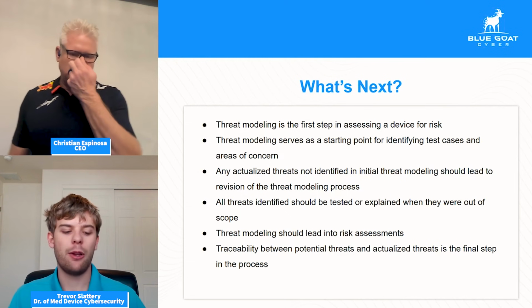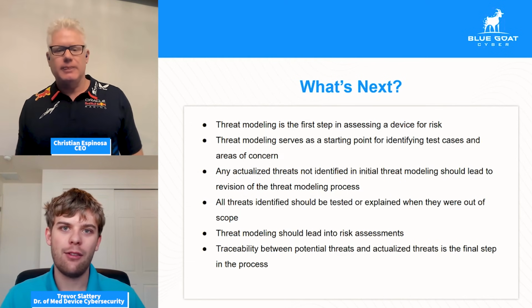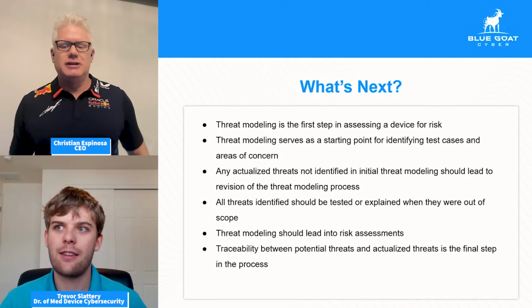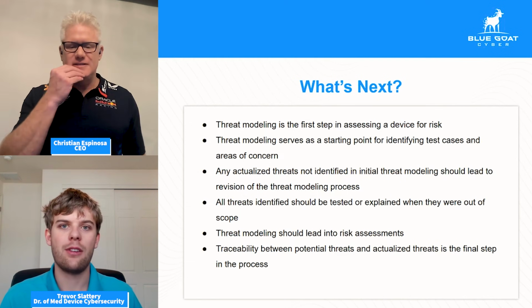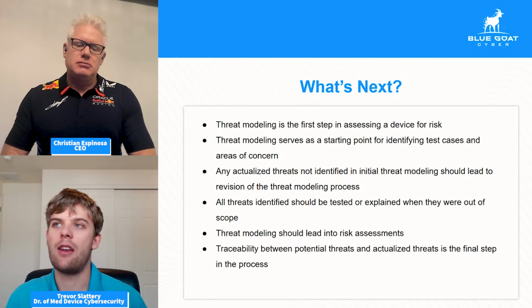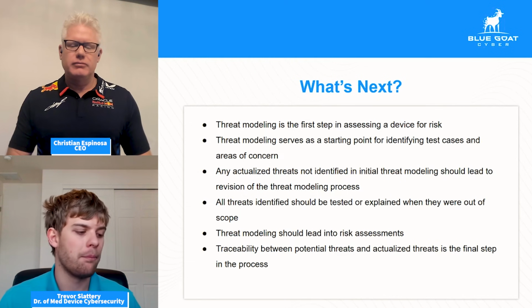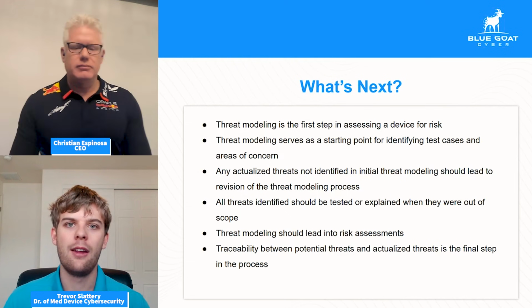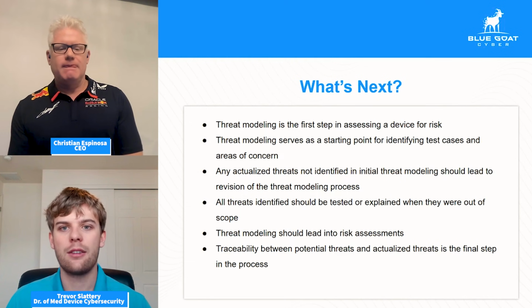Exactly. And even that, when you look at the threat modeling process, that itself can be a threat. We go back to STRIDE. That's denial of service. What if you do 3 incorrect attempts and it locks you out for 10 minutes? That's really bad to have on a life-saving device. Doctors need to be able to get in quickly, but the device still needs to be secure. So what's the middle ground? We can have a quick PIN on the device. We can have it not connect to the internet, so you can't try to brute force the PIN. There are a lot of things that we can do to get around that. So generic fixes for general cybersecurity problems aren't always going to work here. That's why considerations for a medical device are so different compared to a typical network or a typical product.